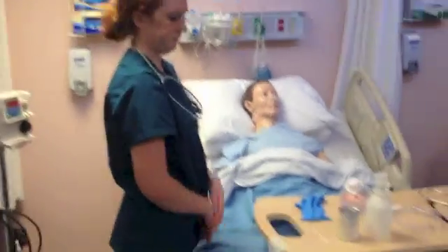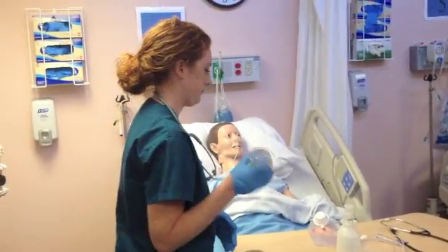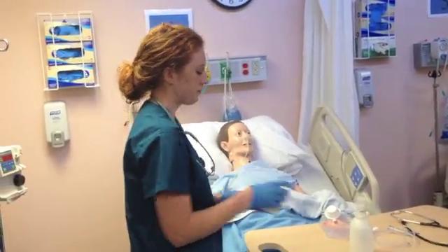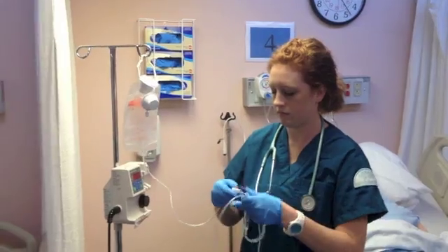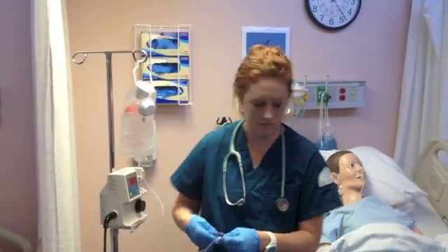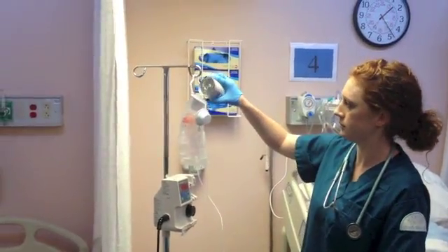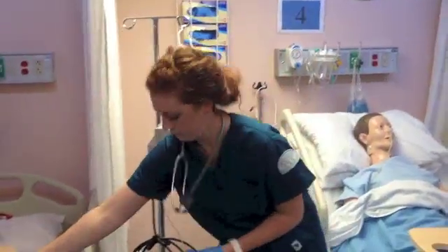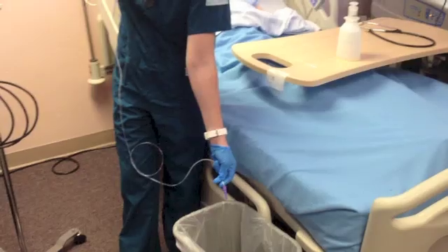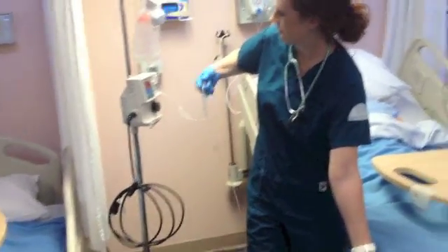Now we're going to get ready by taking our formula. We're also going to verify that it's been at room temperature. Okay. Next, we're going to fill up the bag and prime the tubing. This tubing has a roller clamp on it, which should be in the off position. We're going to fill the bag with the formula and then open up that roller clamp to prime that whole tube. And when it reaches the end, we can close that roller clamp.